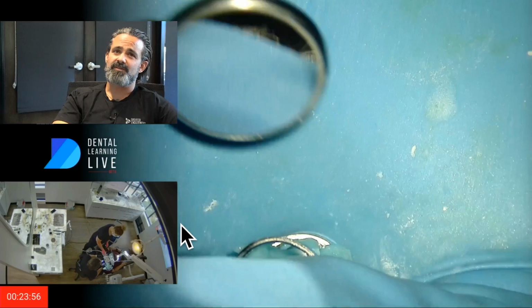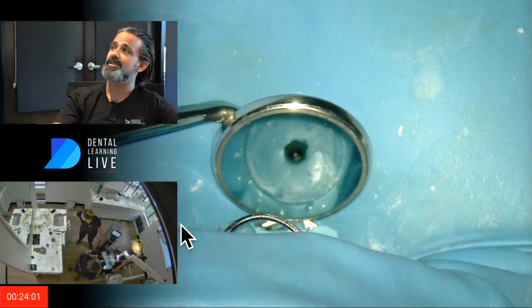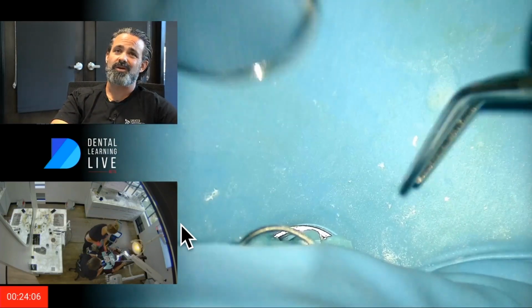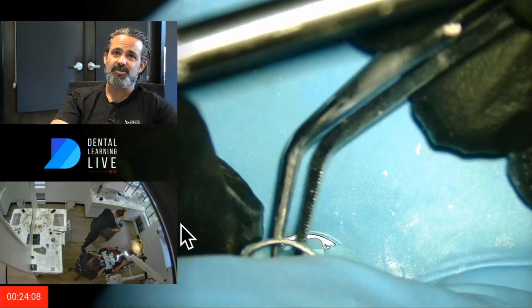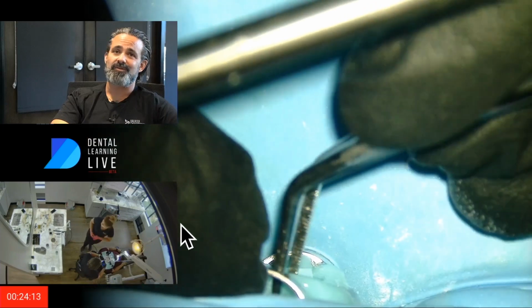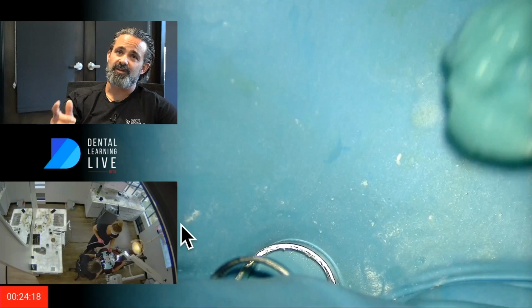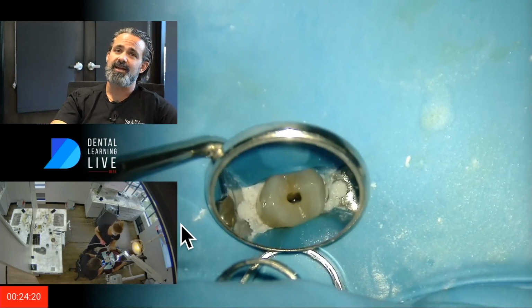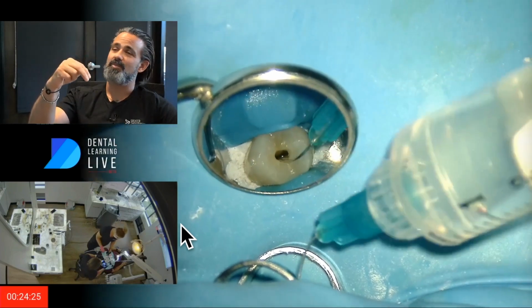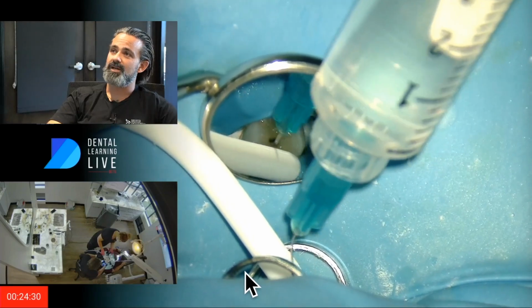The disadvantage of a double-winged clamp is a lot of times that buccal bow, the bow that's on your mesial side, I should say, not buccal side, but the mesial side, can feel in the way. So I find myself using longer instruments when I use that. Whereas I would normally be using a 21 file, even though this was short, I'm still using a 25 file just for convenience over that bow. And I find that stovetopping it, like I said, also makes it easier to work upon the platform for the same reason. It just gives you room so this bow doesn't get in your way.